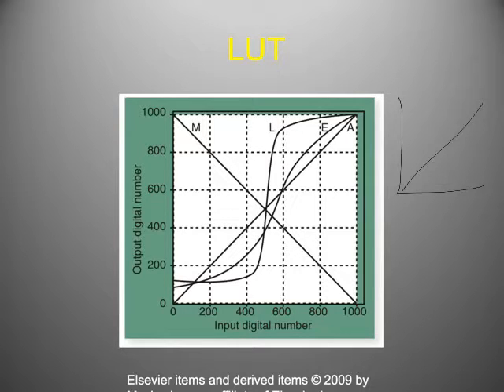We talked a little bit about this last week when I said that the creation of contrast in digital radiography is no longer specifically tied to kVp, right? It's tied to some computer processes. And one of the primary things that drives the visible contrast on our images now is this thing, the LUT. It means lookup table.